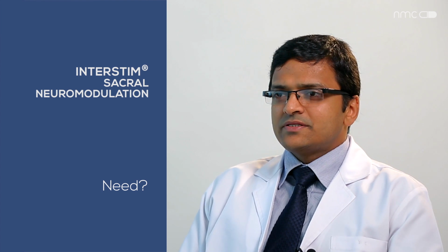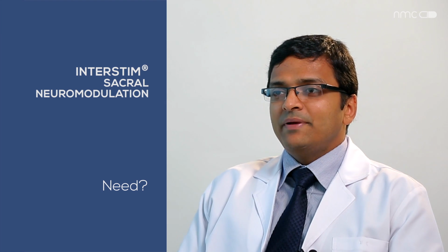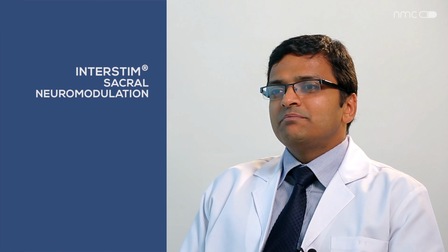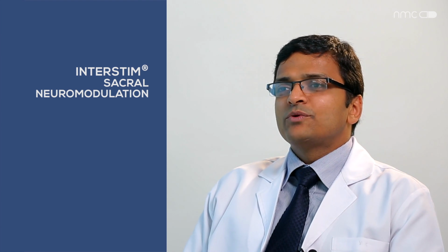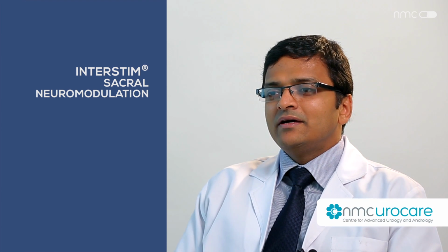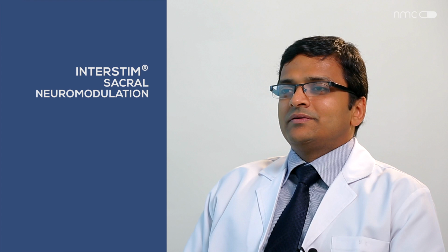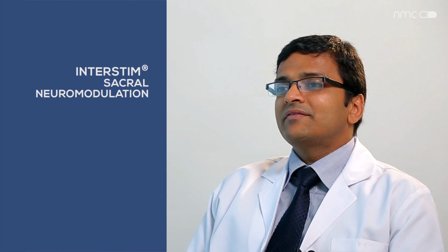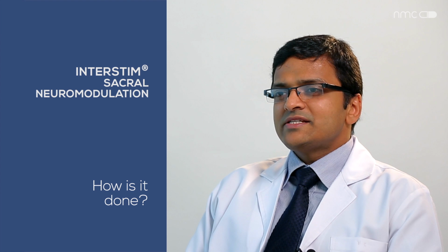Patients in urology presenting with various voiding symptoms, particularly urge incontinence, as I discussed with the Botox and pelvic exercises. So it is an extreme form of treatment for such patients in whom the previous treatments have failed. The other group is those who have pelvic floor spasticity, and lately some role has been found for patients who have pelvic pain. So these are the three groups who would need it once the less invasive therapies have completely failed. It is a surgical procedure which is not categorized as a major surgical procedure.